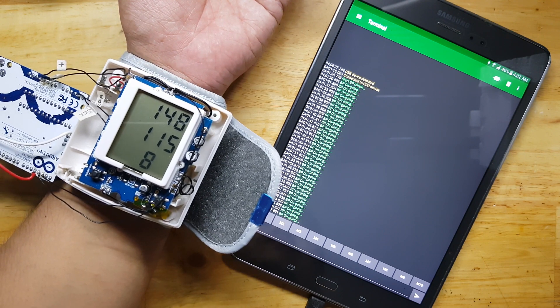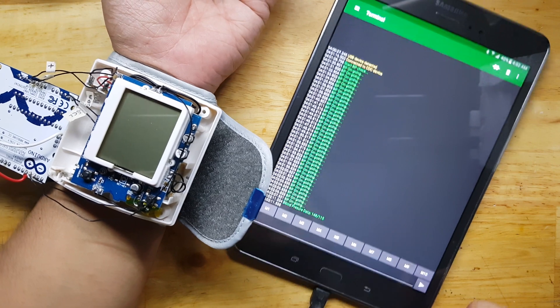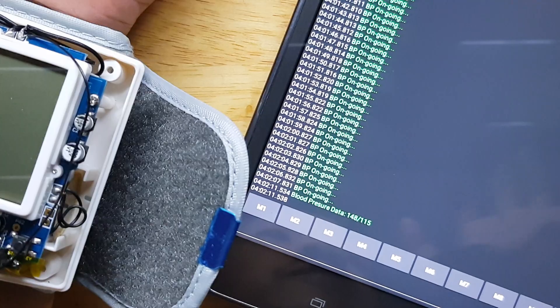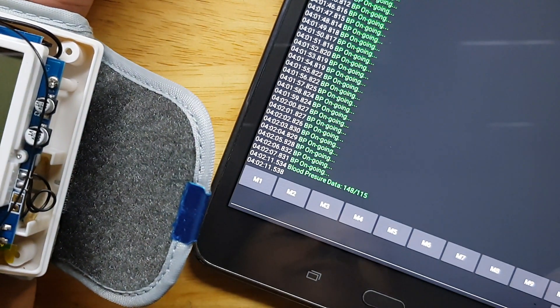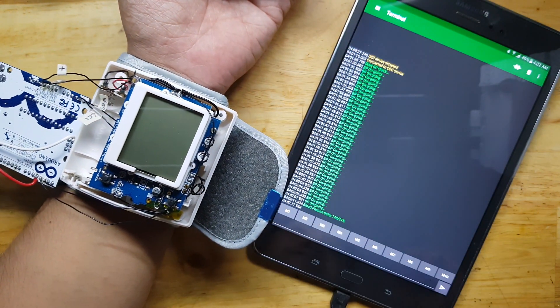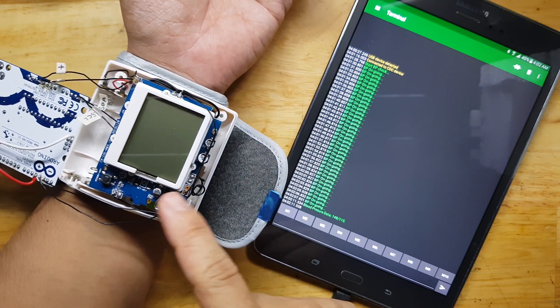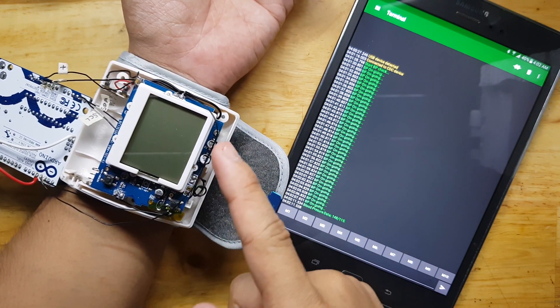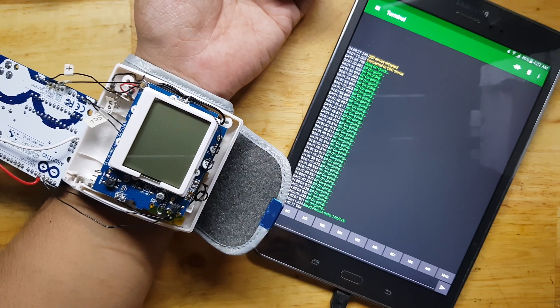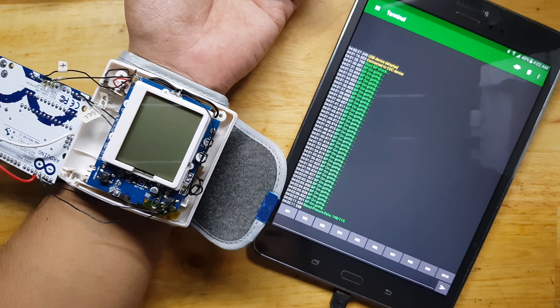148 over 115. There you go, it's 148 over 115. You might think my blood pressure is high, but I need to put this cuff at heart level, and I cannot do that because it's on the table. If I do it properly, my blood pressure will actually be much lower.